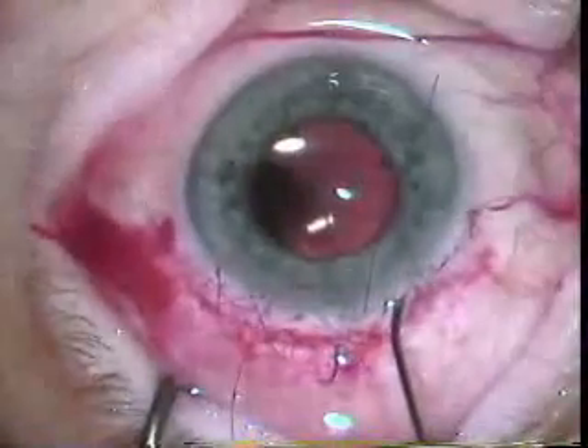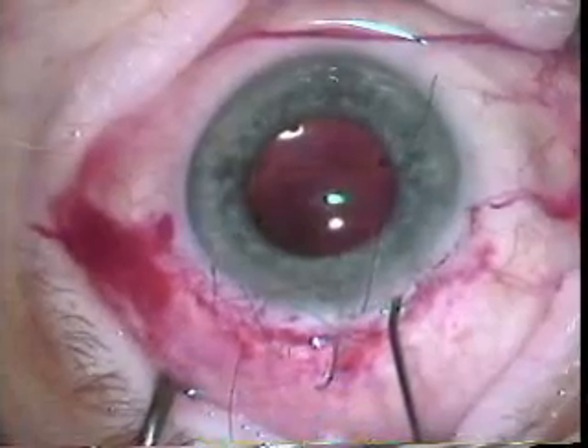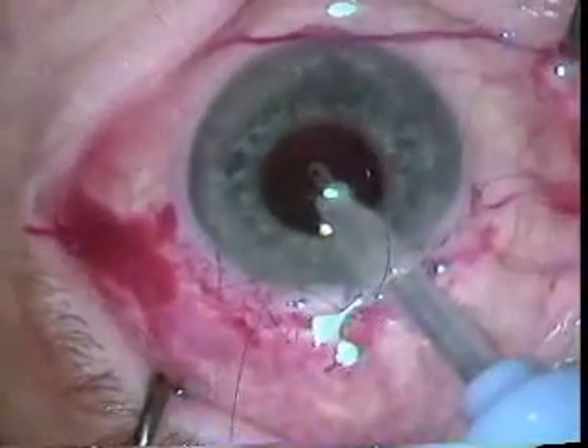Here Dr. Colder does a nice closure with a running 10-0. Some residual viscoelastic material is removed, and then this 10-0 running nylon suture is closed.